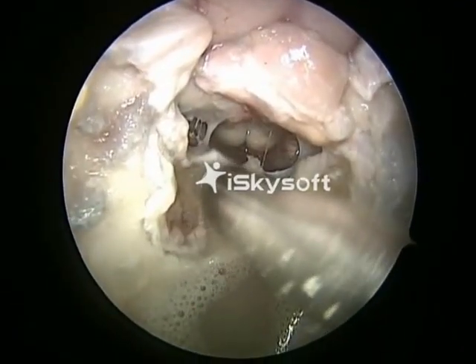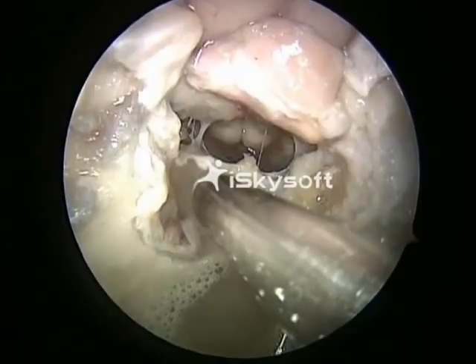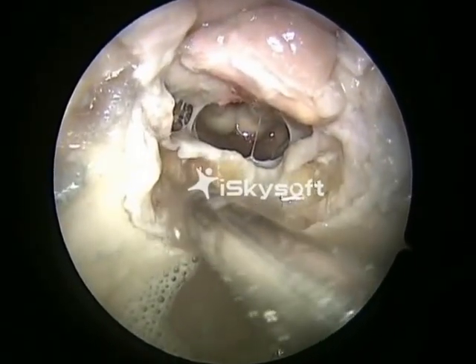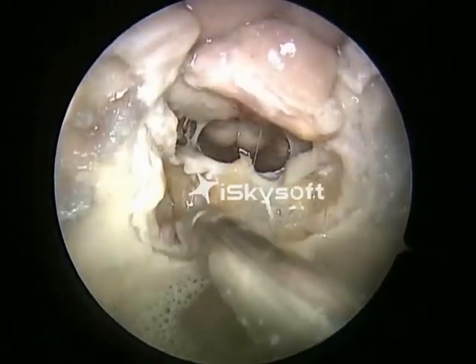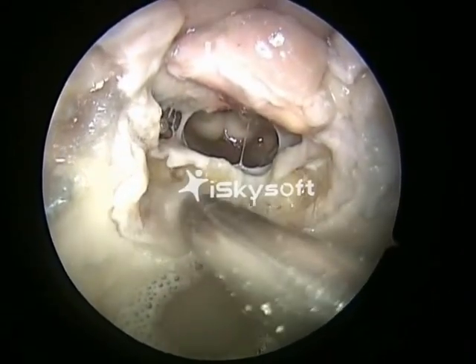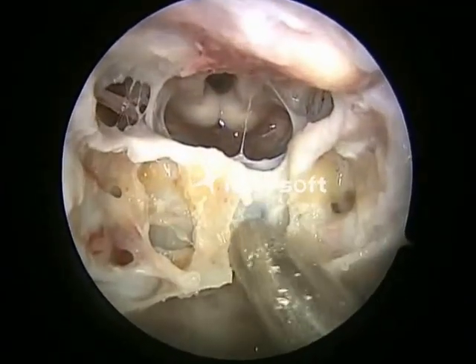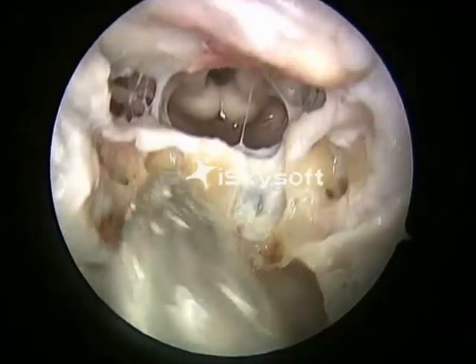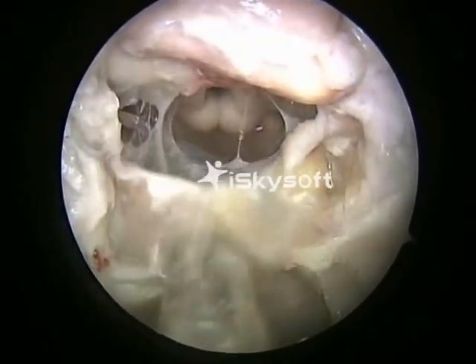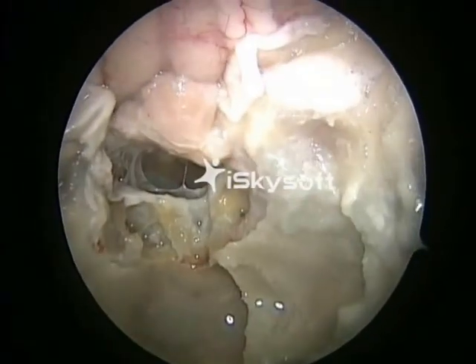It should be remembered that the pituitary gland is a part of the upper clivus. In fact, we call the upper clivus pregnant with the pituitary. We are making two shoulder osteotomies and the bone in between is removed. You can see the dura behind. Care is taken not to injure the dura.